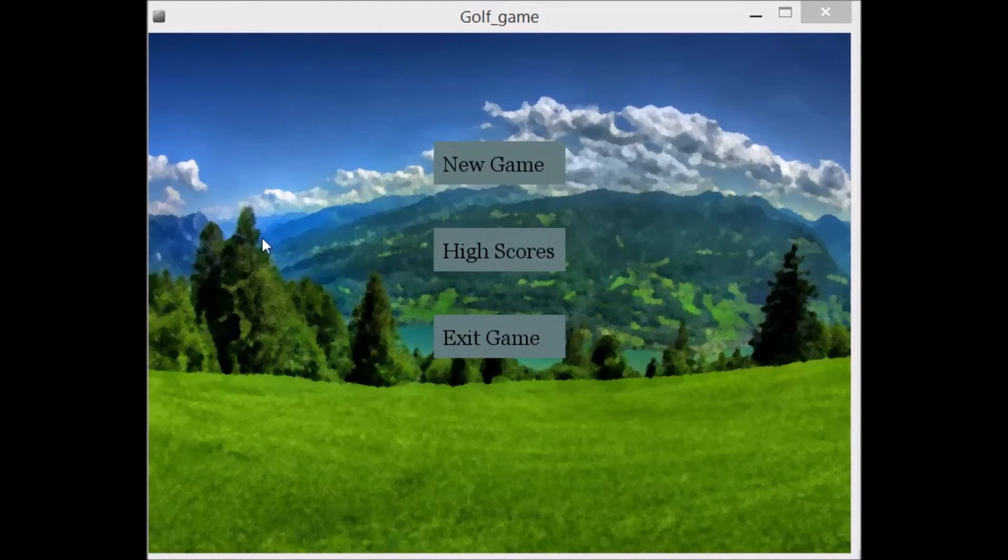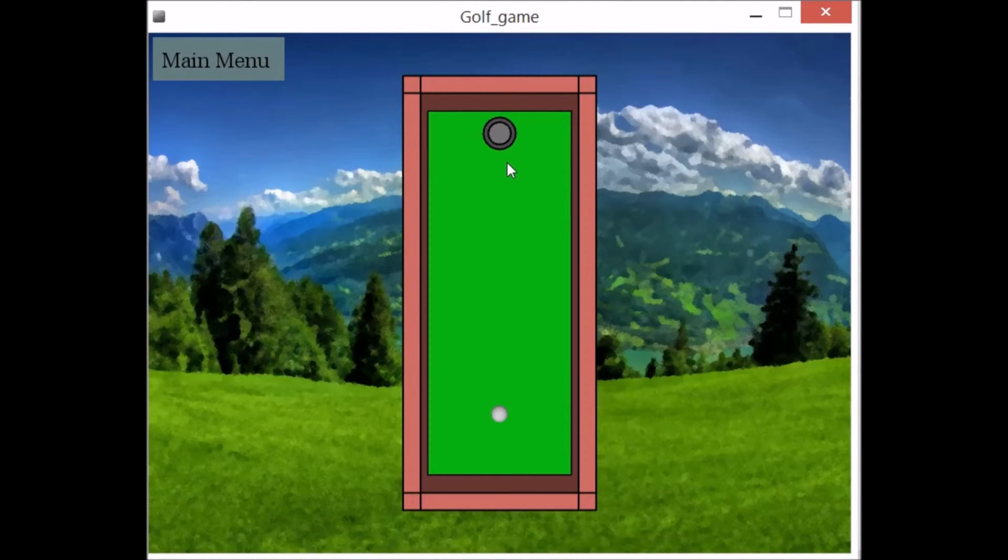So here's a demo of our game. So here you can see the main screen. We have a new game button, a high scores button, as well as an exit game button. The high scores button is not implemented yet. However, if this was going to be a tool used out in industry, you'd want to implement this because this is how you would be able to tell how far a patient has recovered. But that being said, we're going to start a new game here.